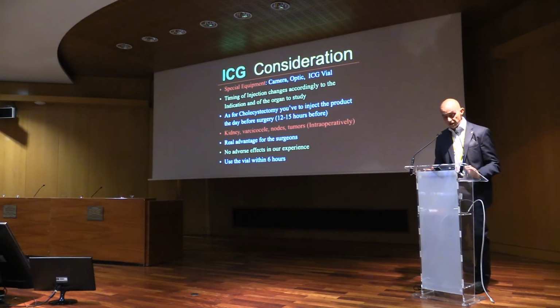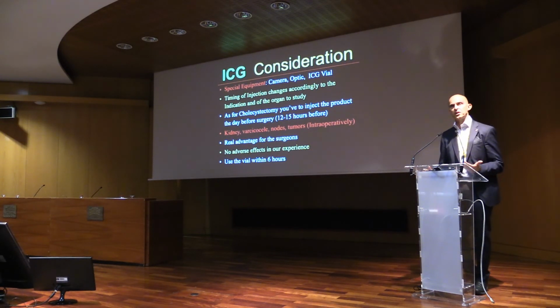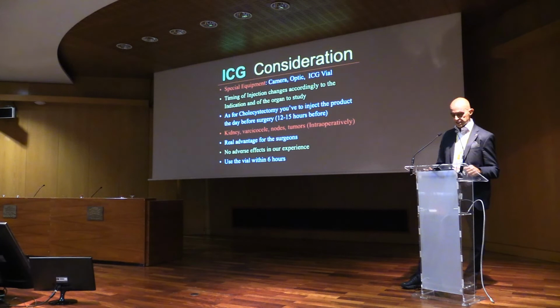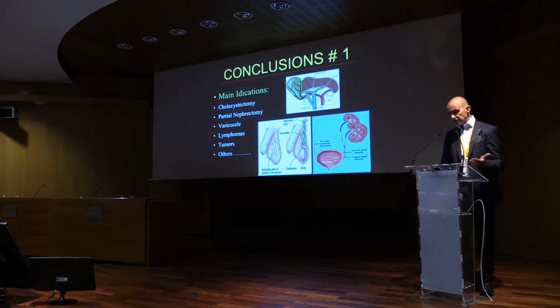I think that there are real advantages for the surgeon. There is no adverse effect in our experience and on the basis of a literature analysis. You can use the same vial for different patients, because you can use the vial after you put the sterile water inside for 6 hours. For this reason, during the morning you can use it for several procedures. Next. These are the main indications.